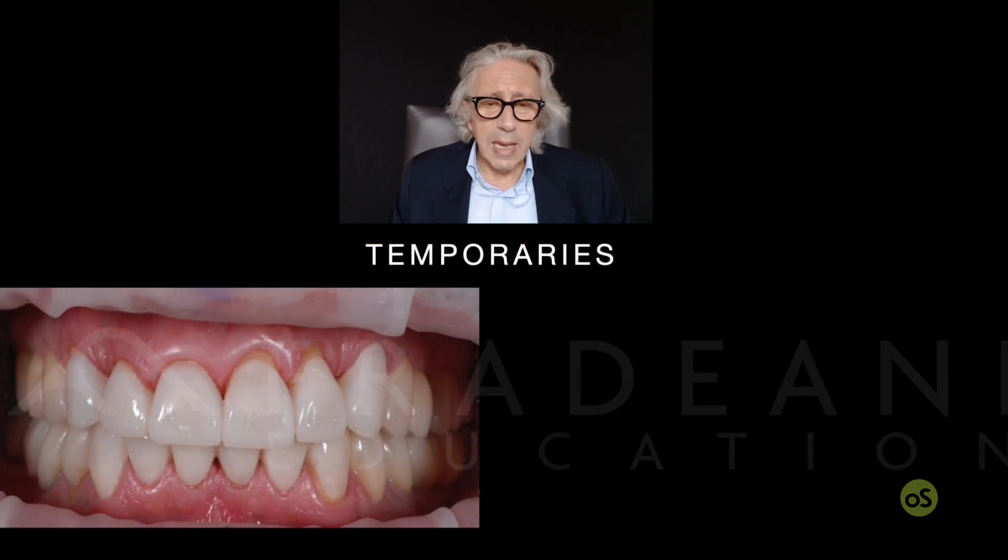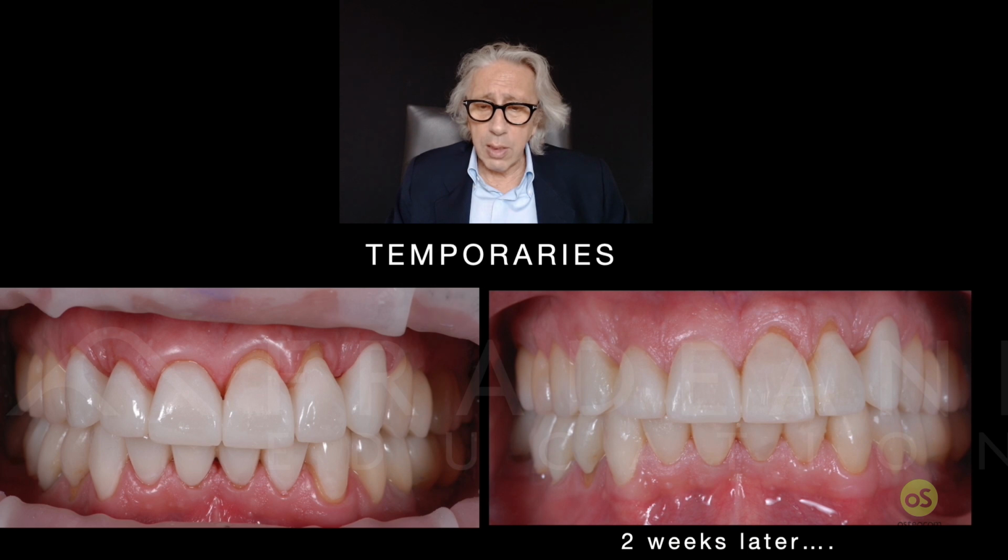Provisional in place. At the time of insertion, we have shortened the left central incisor and lateral incisors. You see some irritation of the soft tissue, that is normal because you have taken maybe the impressions, but look, 2 weeks later, perfectly harmonized. Why? Because we have taken care of the marginal fidelity with our burrs, with our experience, still keeping our margins in the lateral and central incisor left side far away from the margins, but you see that all the other margins are perfectly integrated biologically.